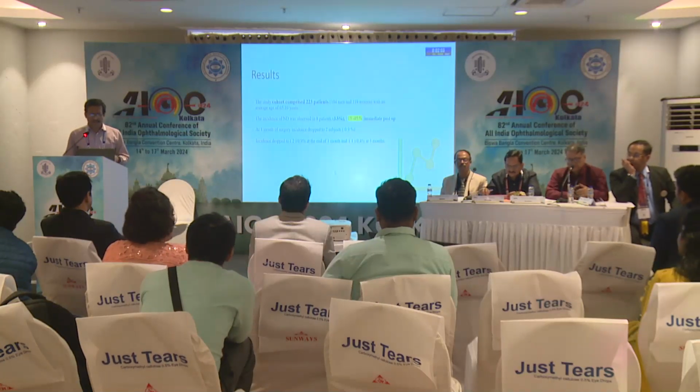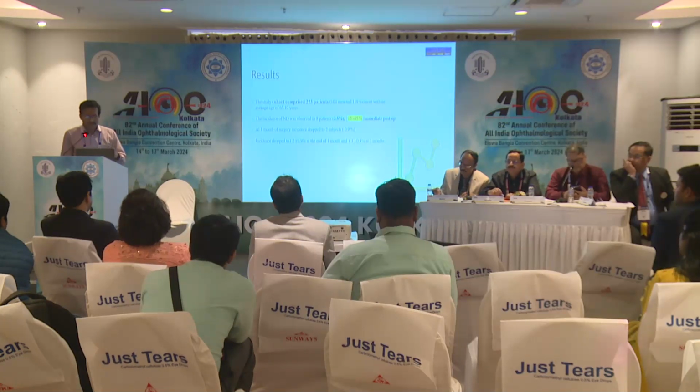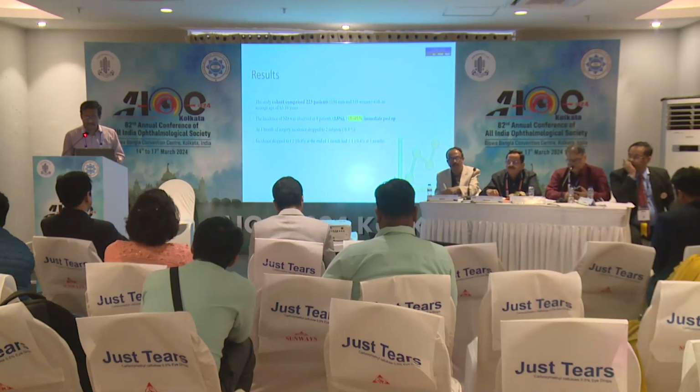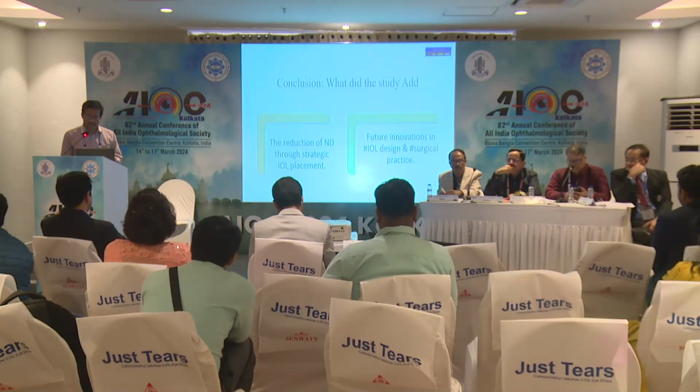So the results: 223 patients were taken up, of which negative dysphotopsia was noted in the immediate postoperative period in 3.5%, vis-a-vis 15 to 45% in the immediate postoperative period as reported in the literature. So what does this study add? The reduction of negative dysphotopsia through strategic placement of the IOL is possible. Furthermore, innovations in various types of IOL design and surgical practice can be done based on this.